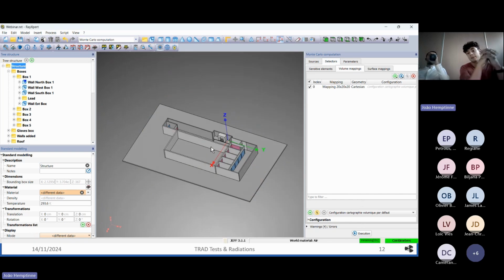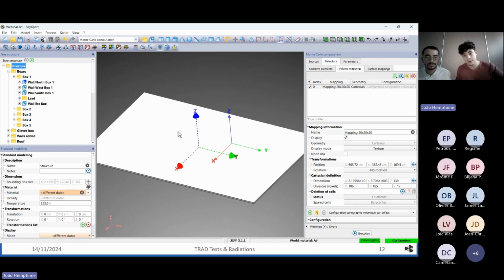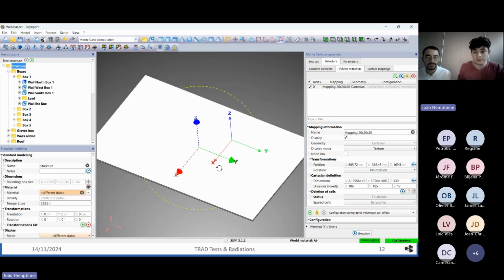So here, often in radiation protection studies, the customer wants to know a general dose distribution in his hospital, for example, right there, because he wants to be sure that all the dose criteria are respected. Okay, so in order to know that, I set a 3D mapping that covers all the area of the model, and here you can find the different settings in order to set your 3D mapping.